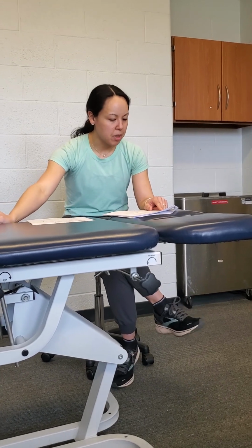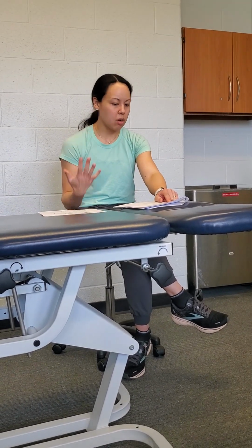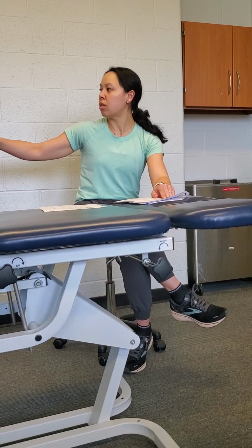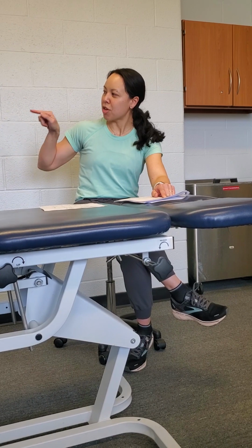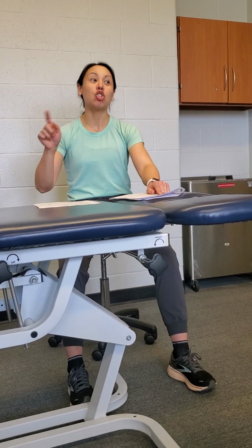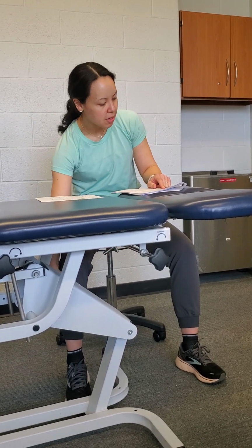So the ratio is typically 1-to-1. You want that 2-second concentric phase, 2-second eccentric phase, so you don't have to worry about one being longer than the other. Always have 30 seconds of rest between sets, and the machine will tell you, because it'll tell you the work, and then it'll say rest, and then you hit the rest button, which gets a little annoying because you have to physically hit the rest button each time. So you really have to pay attention to what the machine's doing and what the patient's doing, which is not a bad thing. You should be paying attention to that anyways.